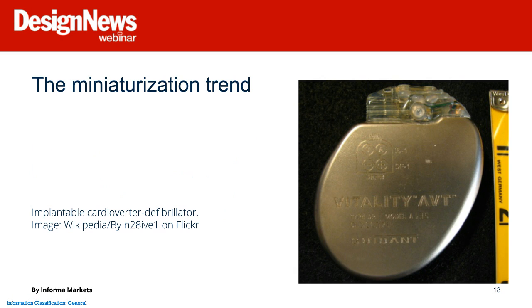And here we move on with a little more of the miniaturization trend. This is an implantable defibrillator, the modern-day cousin of the pacemaker. But this one is actually more than just a defibrillator, and that's what's important. It's a cardioverter defibrillator, and it has 3 stages rather than just one. Remember that we mentioned how the single-stage defibrillator was terrifying its recipients, many of whom preferred the risk of death to the therapy.